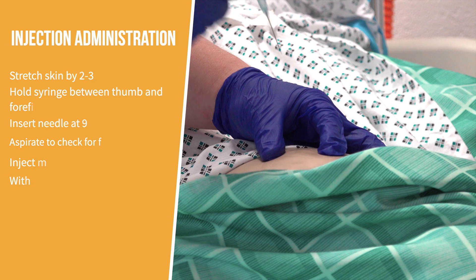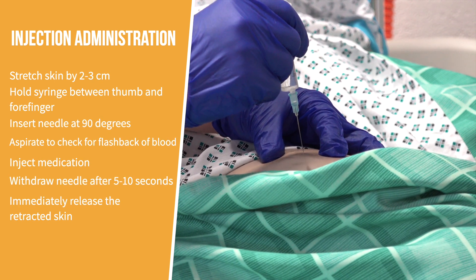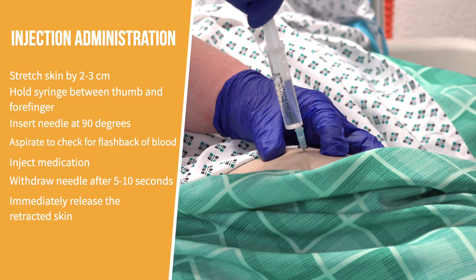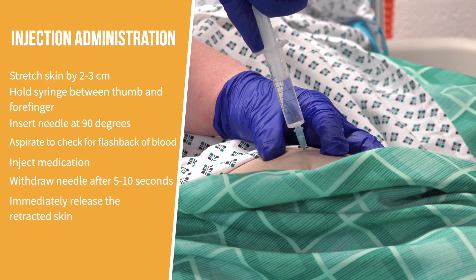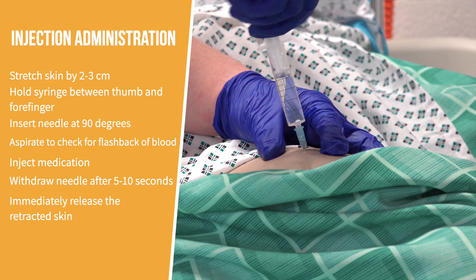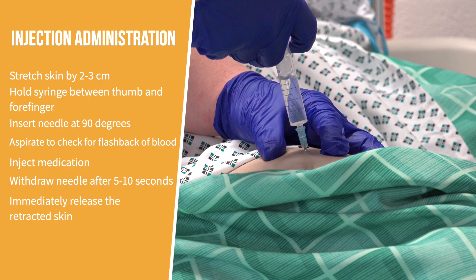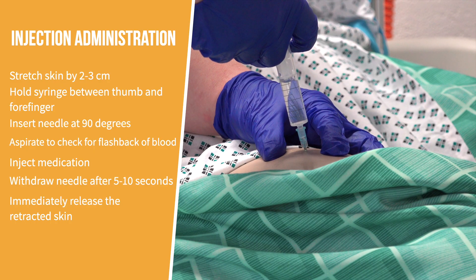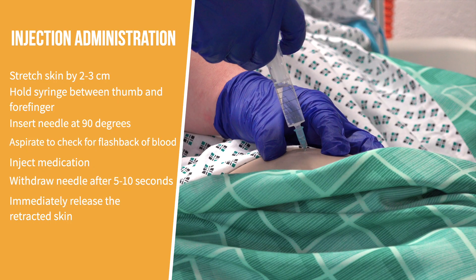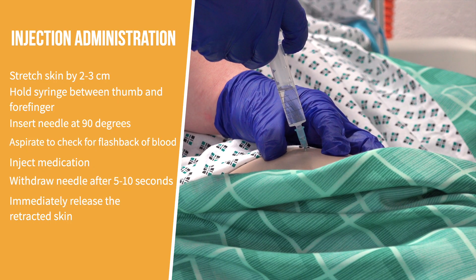Hold the syringe in your dominant hand. Use the Z-track technique and insert the needle at a 90-degree angle with a dart-like motion. Gently pull back on the plunger to check for blood return — this helps confirm that the needle is not in a blood vessel.